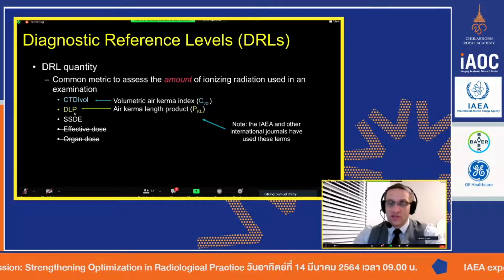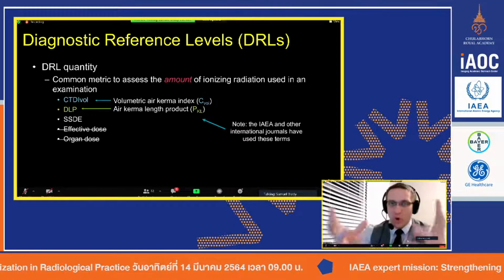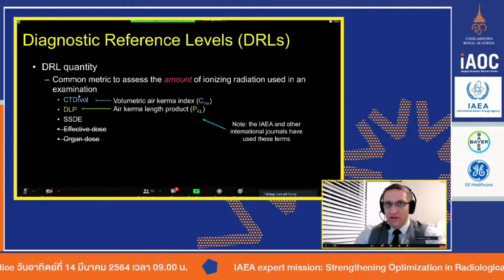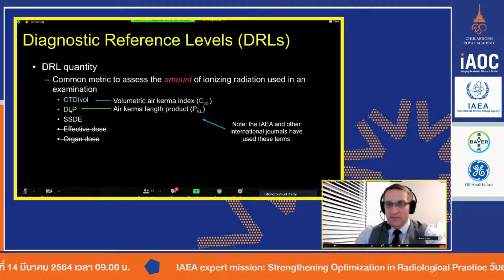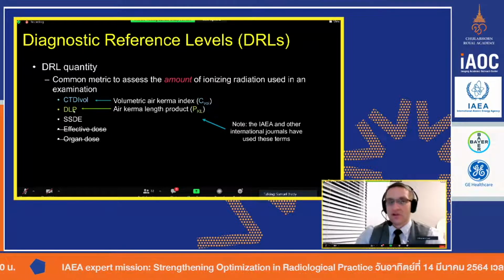What you choose to use, the definition, the title, the wording, that's really on you. Obviously, all the vendors still use volume CTDI and DLP. We here in the US still use these terms also, and Europe also uses them.